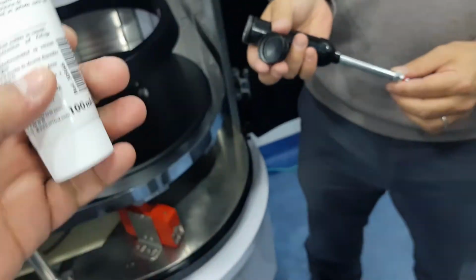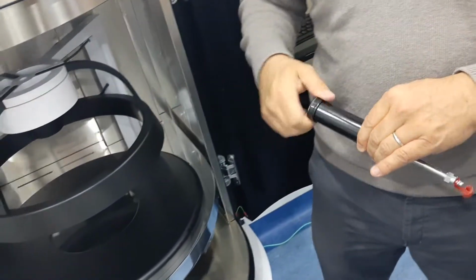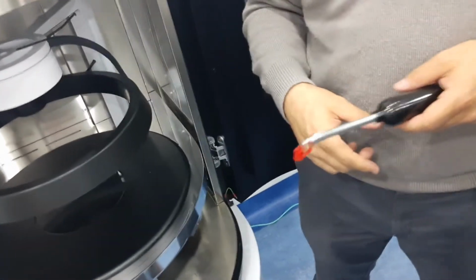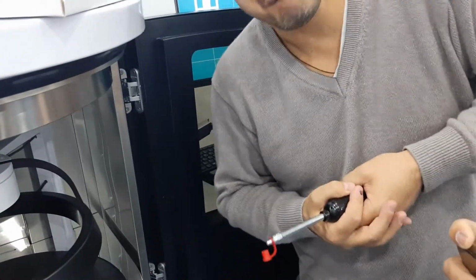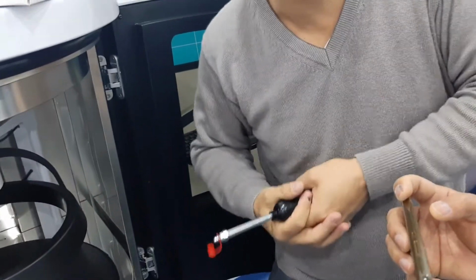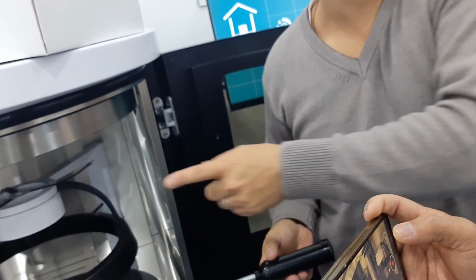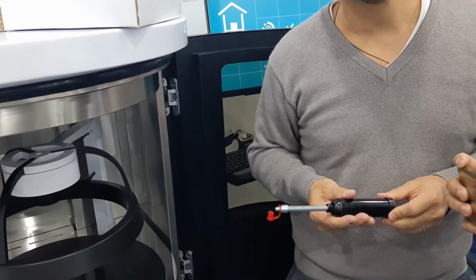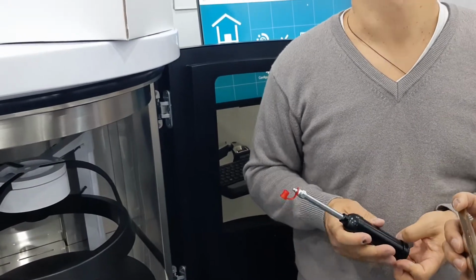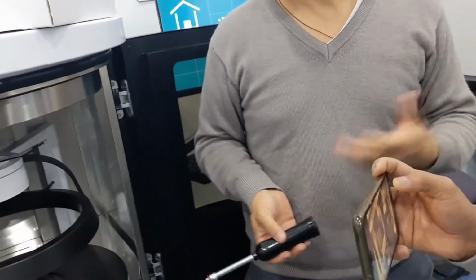This is a pump. You should fill the pump with grease, then you close it, and then you push. It's very difficult. I tried it the other way and it was so difficult. I must have tried 3 times. I was pushing, I'm pretty heavy, and there was a guy holding the arm. I was pushing the other side, and I had to try 3 times. I also took a balance to check the weight and be sure that something was going out. It was a bit tough. Just to let you know, it looks easy like that, but it's not easy. On the other side, I must not exceed 1 gram. If you put too much, it's okay. If you put 1 gram, you'll be happy.